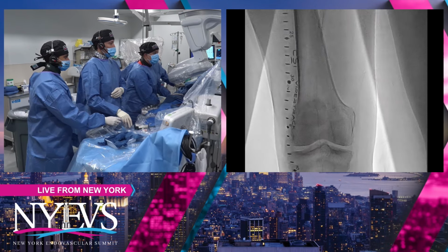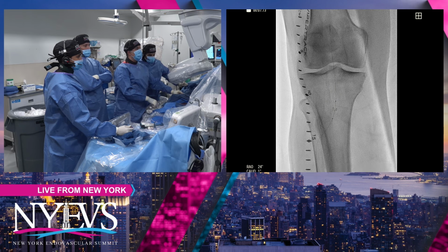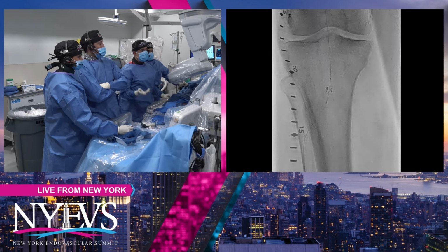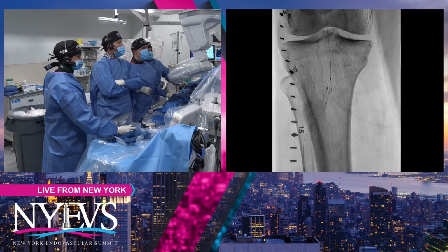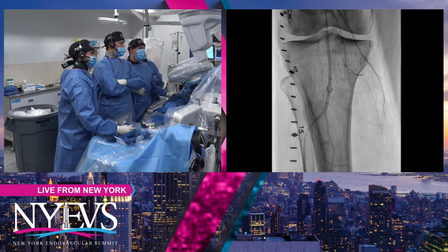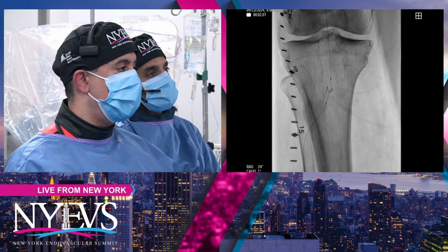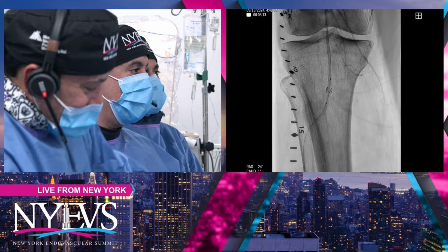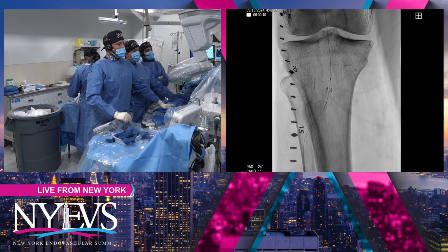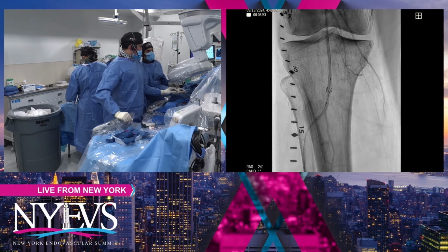Would you take an aspiration catheter down to the filter? Well, we have that ready. I'm going to show you a quick non-subtracted image of the filter just to give us a better idea of what Dr. Zeller is talking about. But we do have an aspiration catheter, Penumbra, here ready in case we need it. So you can see there's a little bit of debris there. But I don't know if that's as impressive as you would think. It looks more like spasm. Correct. Jose, what would you do next?